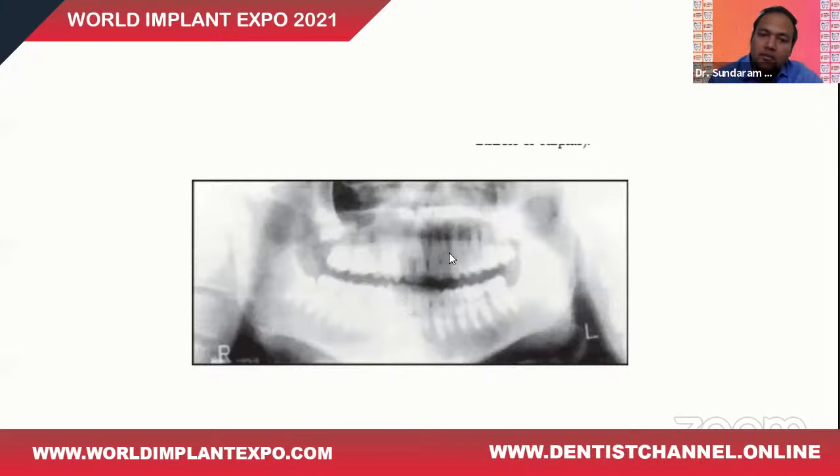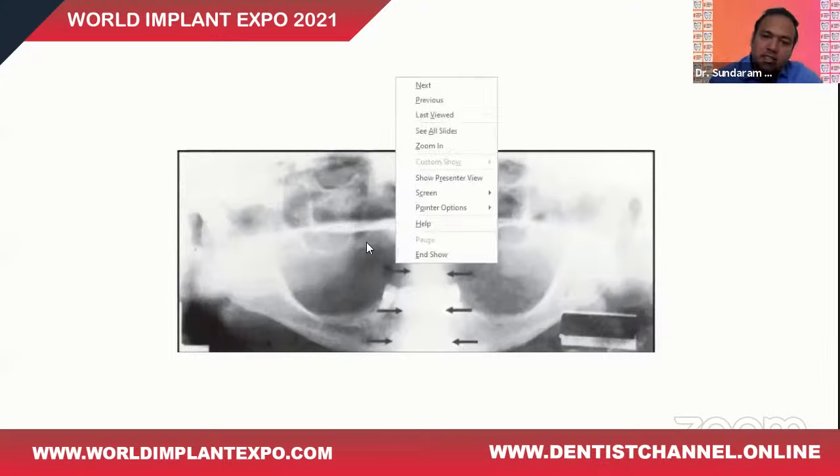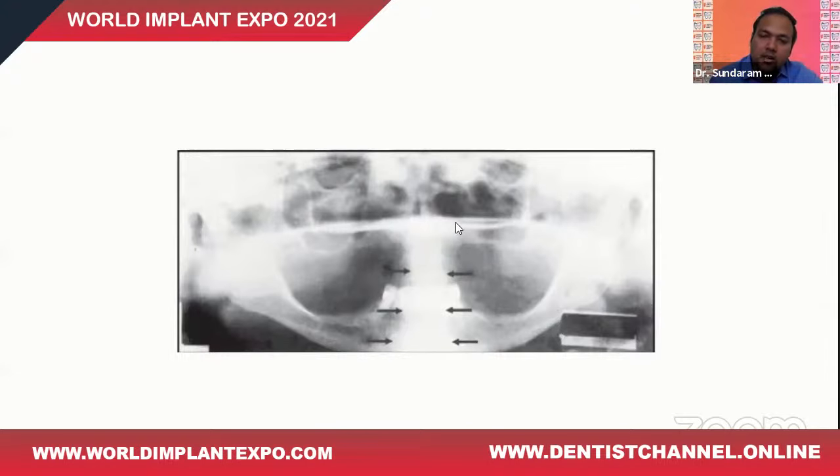You got very narrow upper and lower anteriors, but very broad posteriors. Again, this is because of the spinal superimposition. If I'm going to plan for implants in this region, I will not be able to study completely what bone is available in this region.